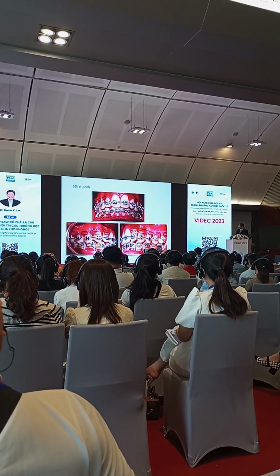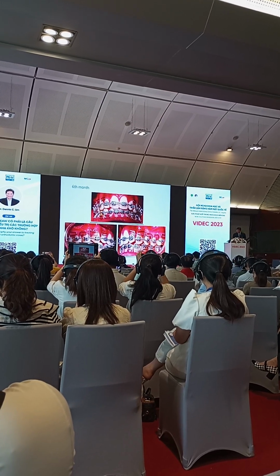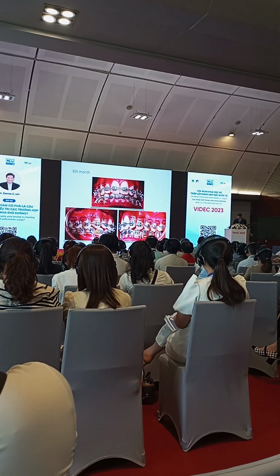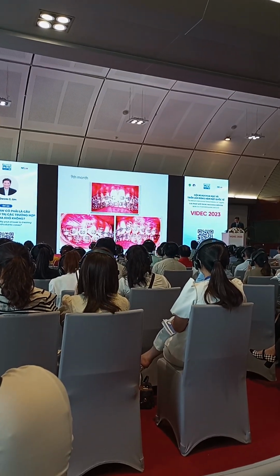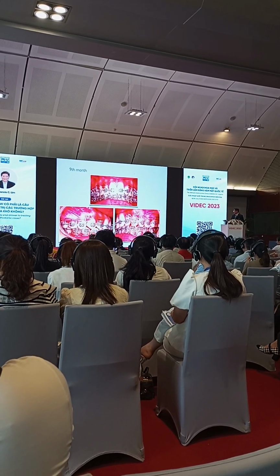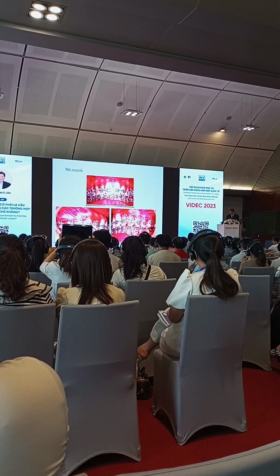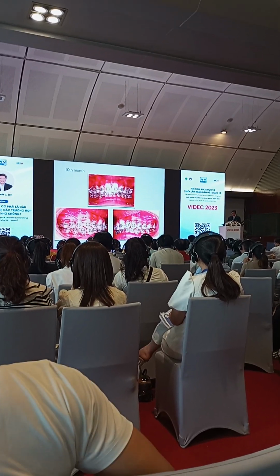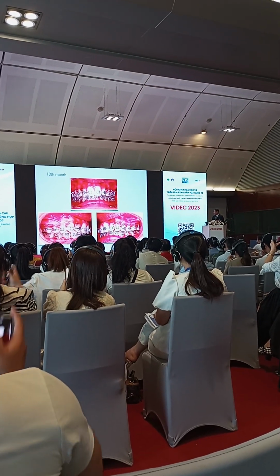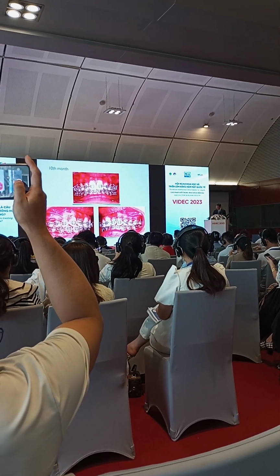This is on the 6th month of the wire. So just improving the interdigitation. And use a little bit of class 2 again to improve further the bite of the patient, until you get into a good interdigitation on the premolar molar area, then you can already remove now the patient.